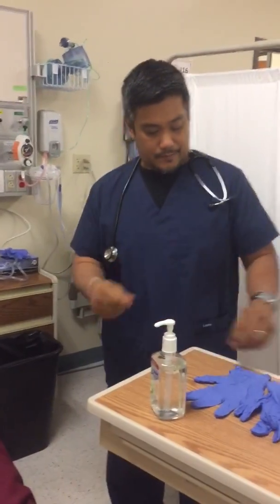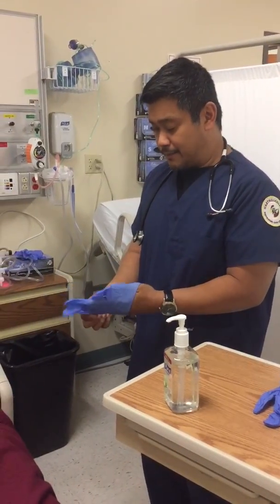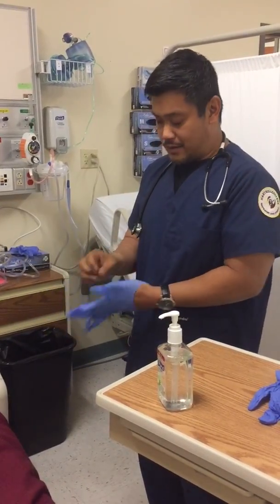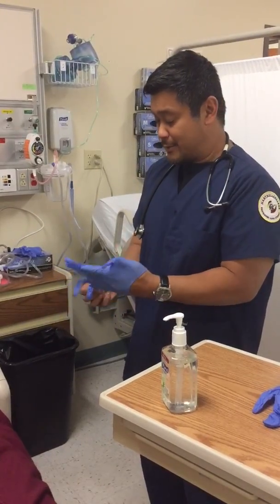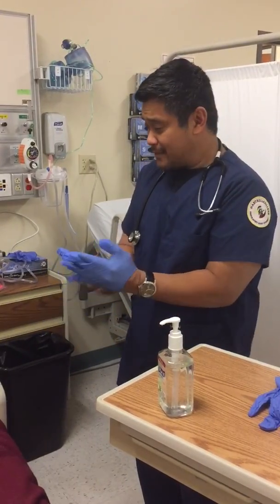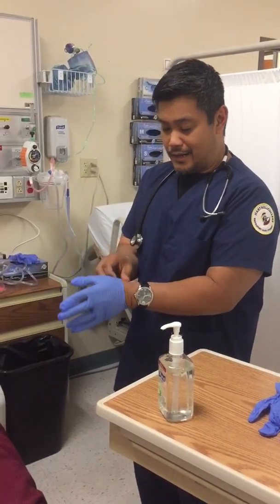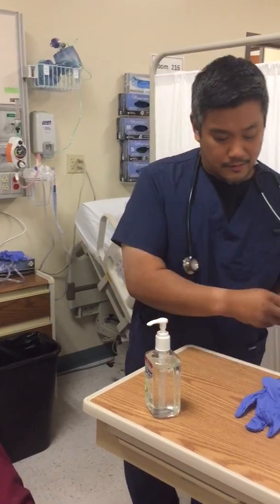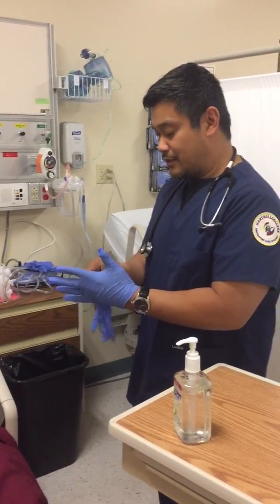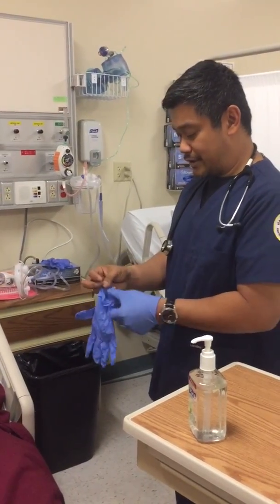Thank you. So we're going to be doing a humidification treatment for you today. Basically, it's going to apply some humidity to your upper airways, and that will help open up your respiratory tract a little bit, make it a little bit easier to breathe, and reduce some irritation in there. There are some hazards, and they're minimal, and of course we'll be watching you. I don't really anticipate anything, but it's something you should know. There are increased risks for bronchial spasms, just maybe closing up your airways a little bit, as well as overhydration, a little bit too much water. Again, this is something I don't anticipate, and we'll be watching everything.